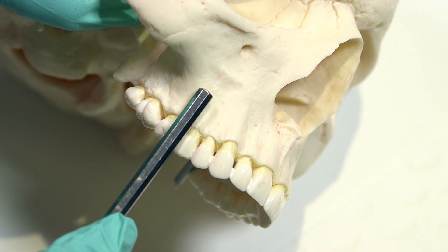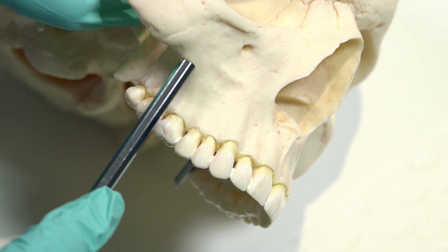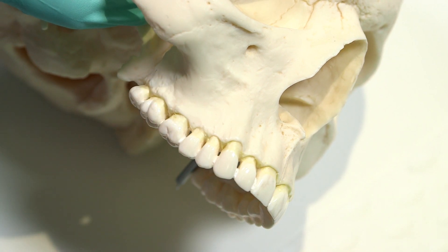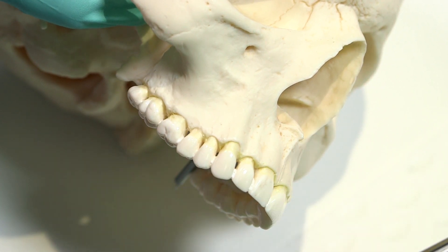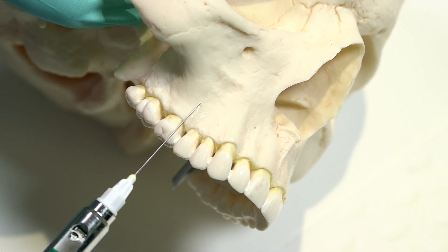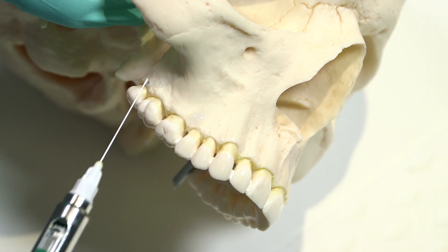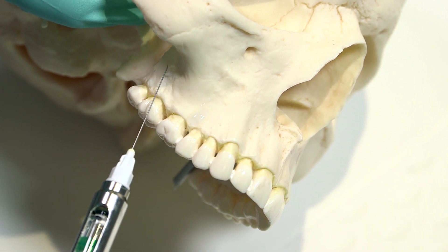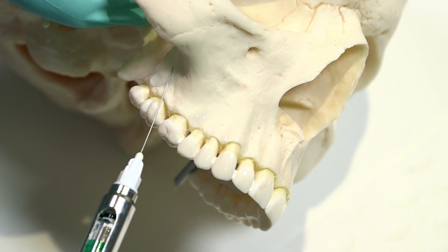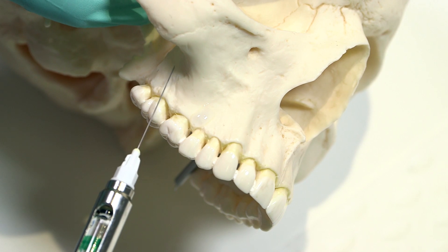For the buccal infiltration, you are aiming for the height of the mucobuccal fold of the vestibule adjacent to the target tooth. The syringe should be oriented so that it is parallel to the long axis of the tooth. This orientation may need to be more oblique as you move posteriorly. The needle should be inserted approximately 3-5mm and then slowly deposit 0.5-1mL of solution.